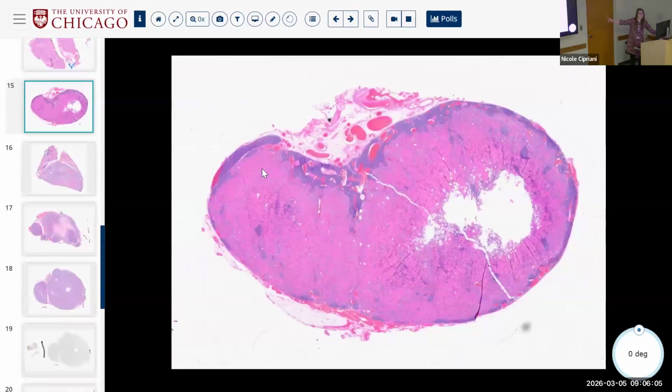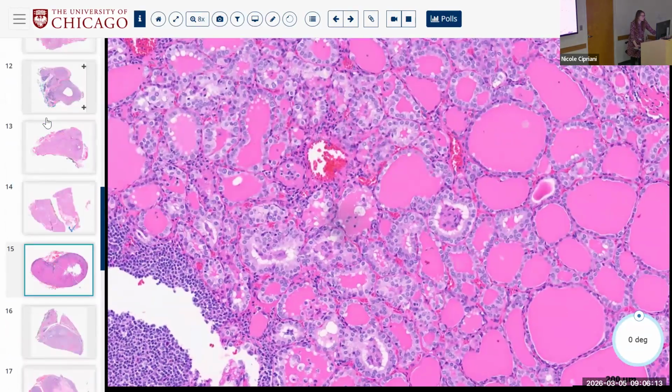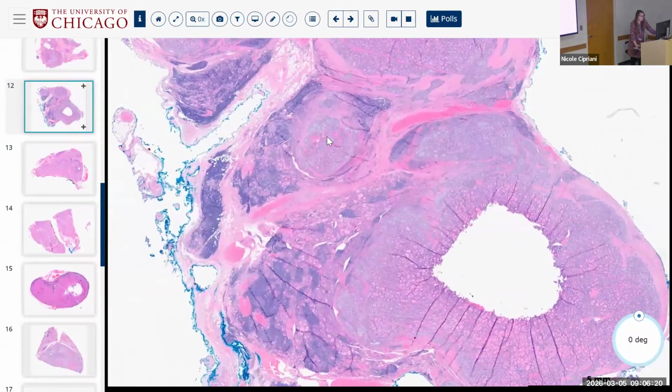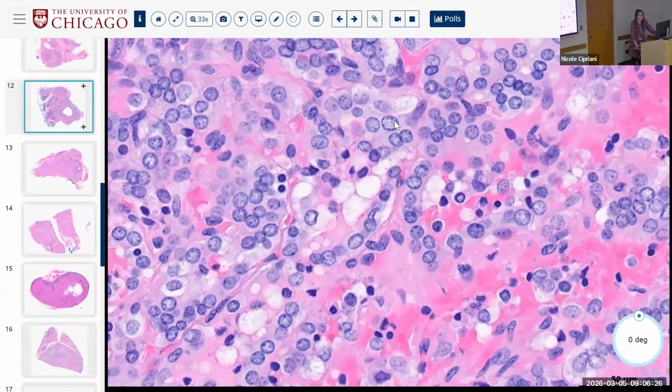And these are the lymph nodes, right? So this is real, right? This is the NTRK tumor in the lymph nodes. So I want you to be aware of how subtle the NTRK tumors can be. This is another example of one that's widely infiltrative, but maintains the follicular pattern and only has very, very subtle, if absent, nuclear features of PTC, right? So you look at these and you come up with your own conclusions.